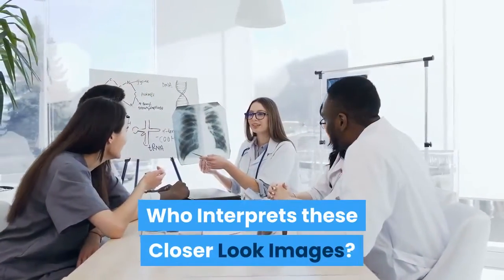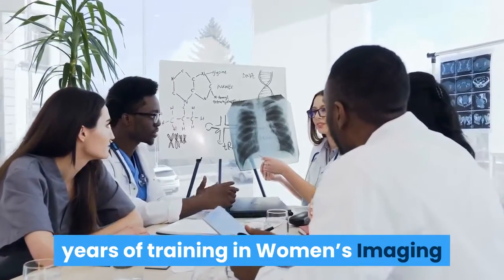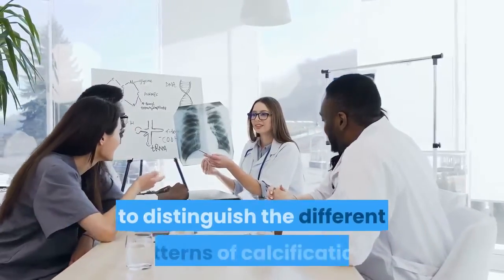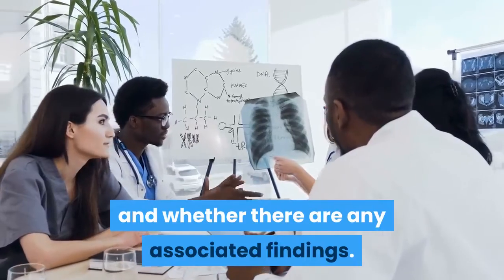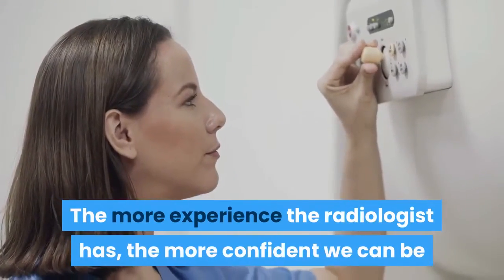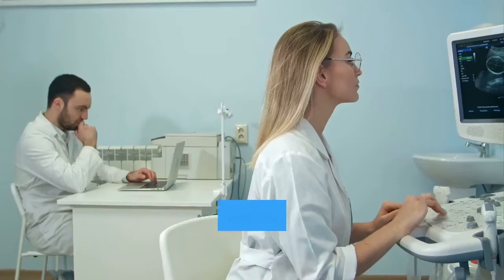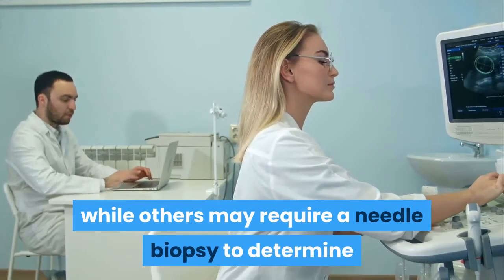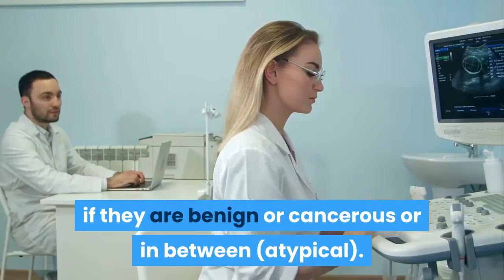Who interprets these closer look images? A specialized radiologist with many years of training in women's imaging or breast imaging interprets the magnification images to distinguish the different patterns of calcifications and whether there are any associated findings. The more experience the radiologist has, the more confident we can be if a particular finding can be followed or if it needs to be biopsied. Some patterns of calcifications can be followed while others may require a needle biopsy to determine if they are benign or cancerous or in between, atypical.